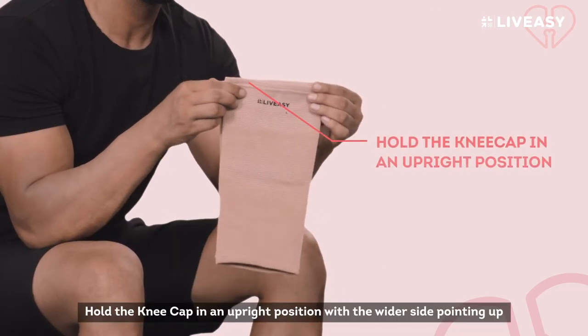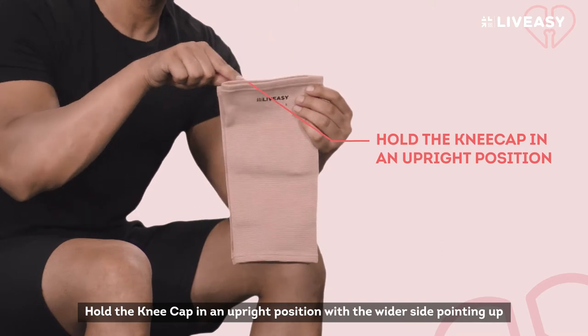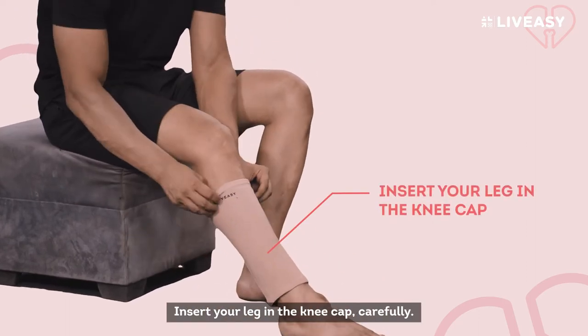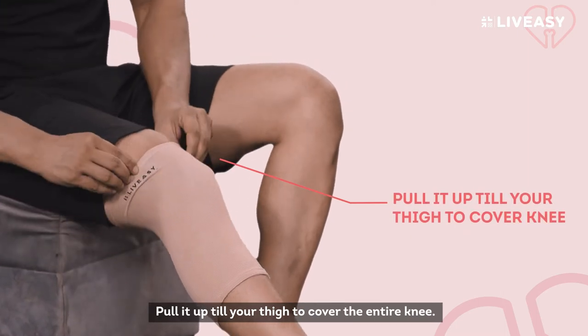Step 1: Hold the kneecap in an upright position with the wider side pointing up. The LiveEasy logo should be centred on the top. Step 2: Insert your leg in the kneecap carefully. Step 3: Pull it up till your thigh to cover the entire knee.